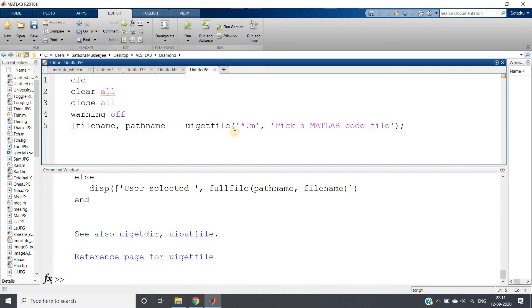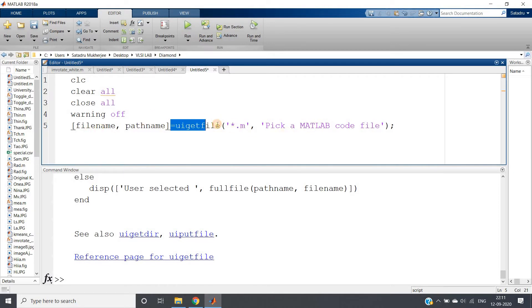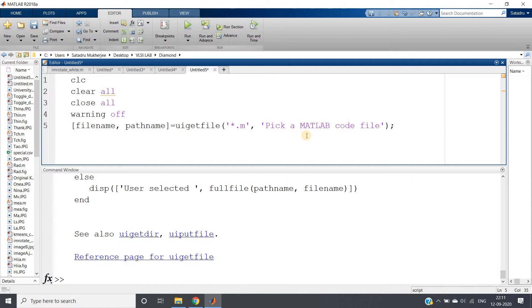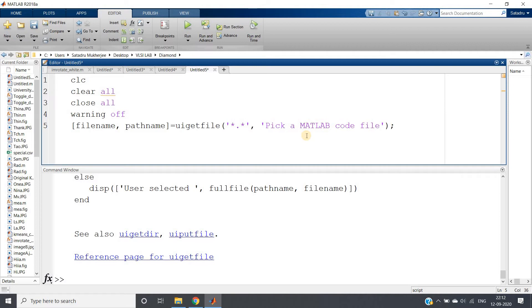So jokes apart, let's do something with this particular one. This one can be used to browse only m file because star dot m extension is used for MATLAB code but we want image. So I will just apply star dot star. Why not jpg? Because image can be png, image can be tif, anything. So for that I am applying star dot star, so any image file can be picked up.